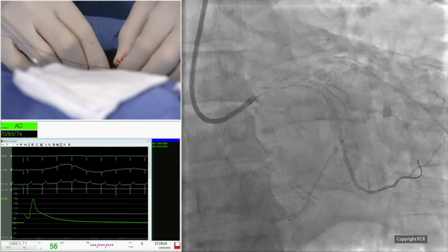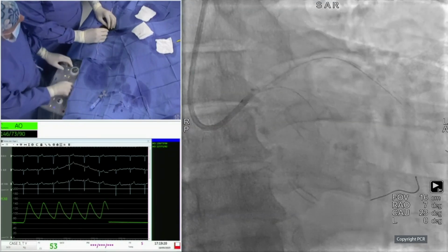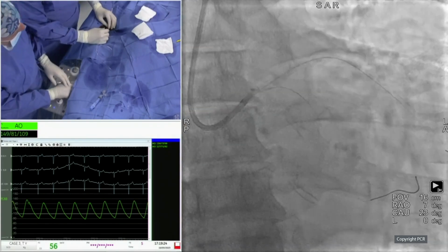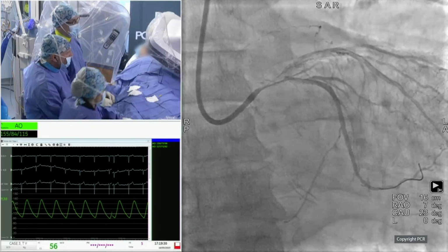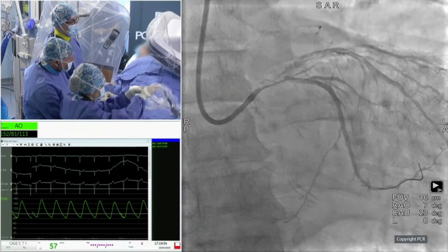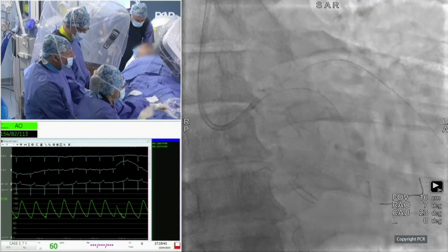Yeah, it looks very nice. I mean, I know people would say this is a stent-like treatment. Yeah, leave it like that. I mean, everything is possible. People are already doing drug coating balloon in the main stem. So if you don't want to put metal there, why not? We have a colleague in Korea who is doing it.